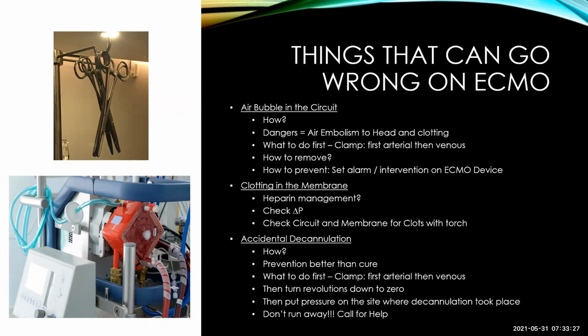It's not an emergency thing, it happens over time. So plan well, and I always say prevention is better than cure, so we don't really want to throw away a membrane that's costing a lot of money, so we'll rather try and maintain it.